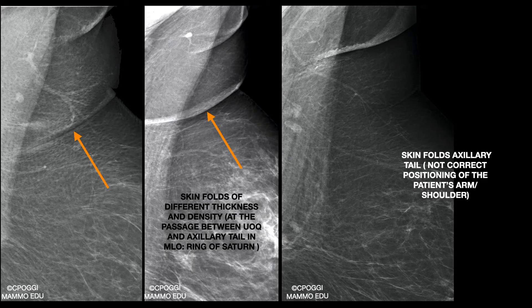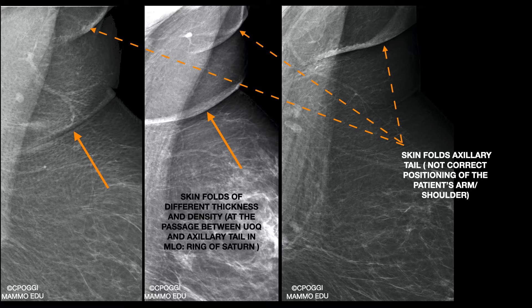A typical ring of Saturn artifacts is found exactly at the passage between upper outer quadrant and axillary tail; it is due to a not effective stretching out of the tissue in this area, and is not always resolvable. On the contrary, these ones are due to improper positioning of the patient's arm and shoulder.